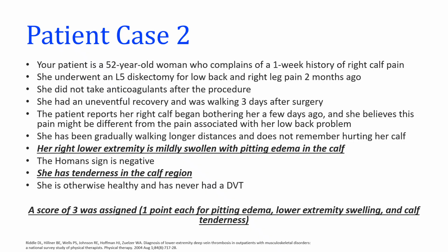According to the diagnostic algorithm, the next appropriate step is compression ultrasound imaging to evaluate for the presence of a thrombus. In this case, the Homan sign was negative. Please note that Homan sign is no longer considered a reliable diagnostic tool because of low diagnostic accuracy.